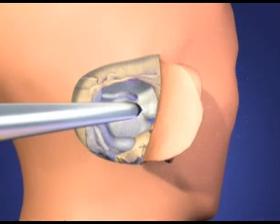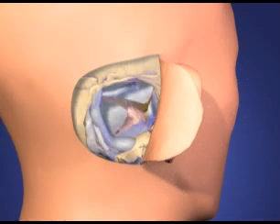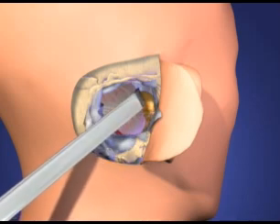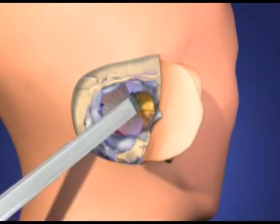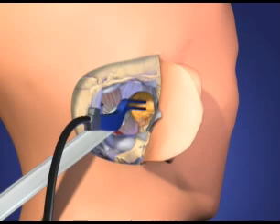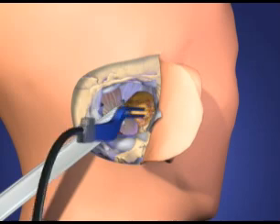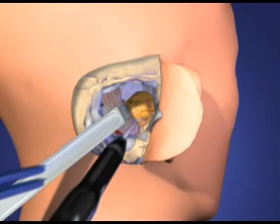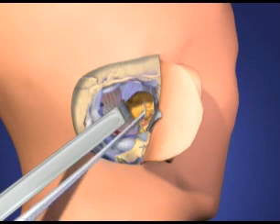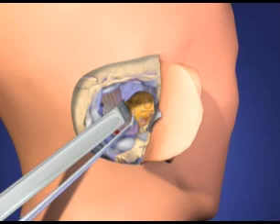Once that is completed, a second team of surgeons is introduced, the dura is opened, the cerebellum is retracted posteriorly, and the tumor is identified, most commonly either an acoustic neuroma or a meningioma. The tumor is gradually resected piecemeal using traditional microsurgical techniques.